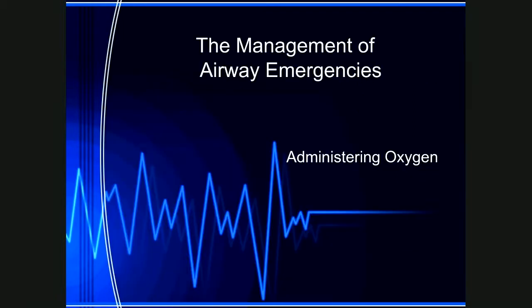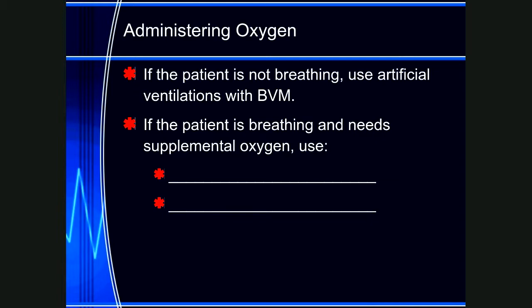Talk about administering oxygen. If the patient's not breathing, we're going to use artificial ventilation with the bag valve mask.